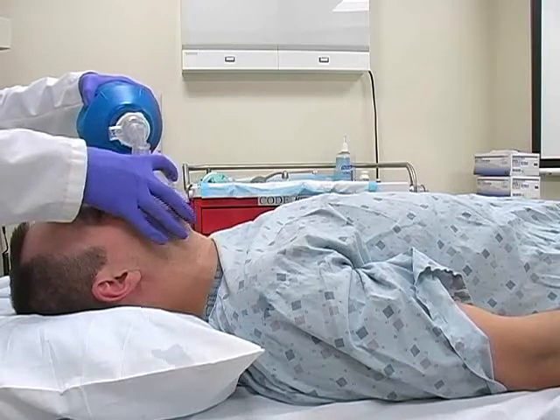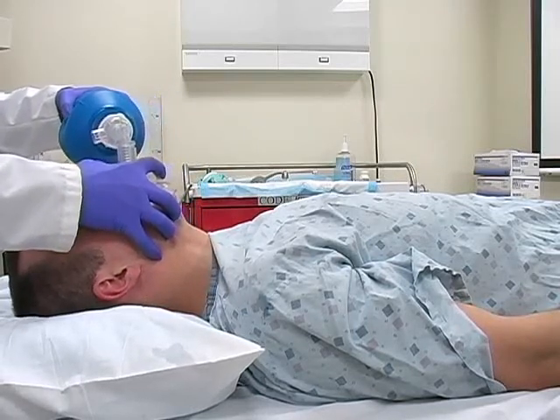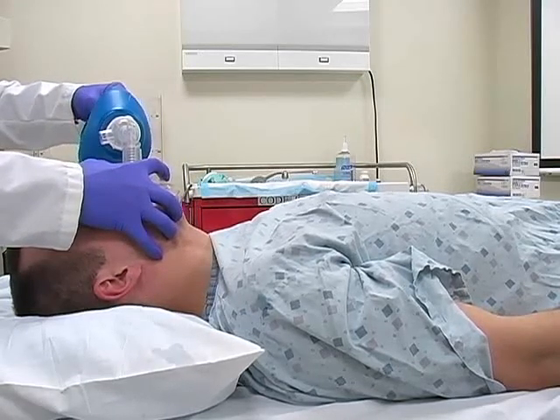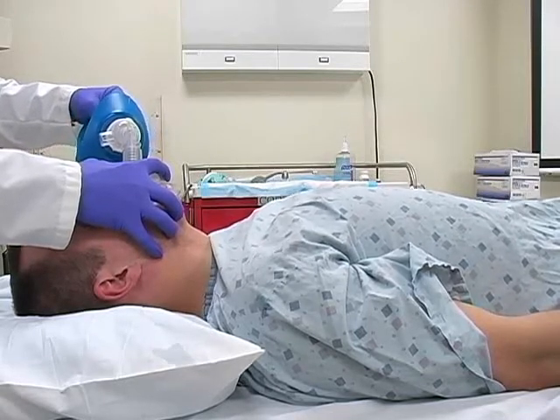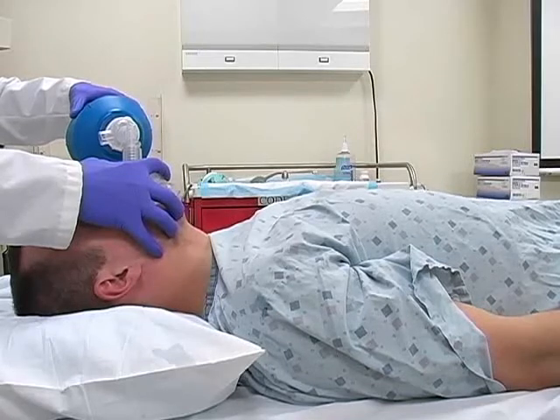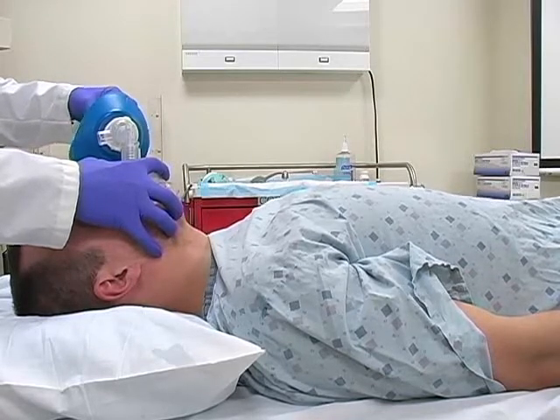Once a good seal has been achieved, begin to ventilate the patient. In most cases, the ventilatory rate should not exceed 10 to 12 breaths per minute. Use a tidal volume just large enough to cause the chest to rise.